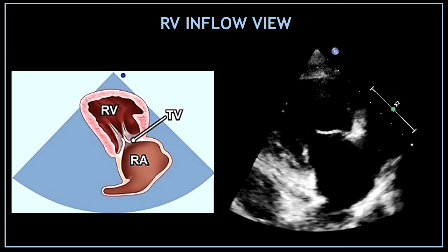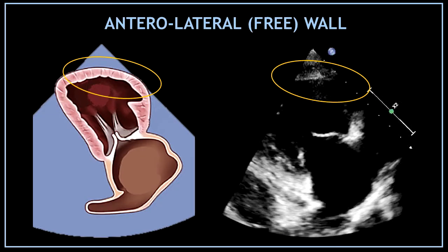Let's start with the right ventricular inflow view. This view looks very similar to the apical two-chamber view. However, instead of focusing on the left heart chambers, in this view we are going to concentrate on the right heart. The first wall visualized at the top of the screen is the anterolateral wall, also known as the right ventricular free wall.